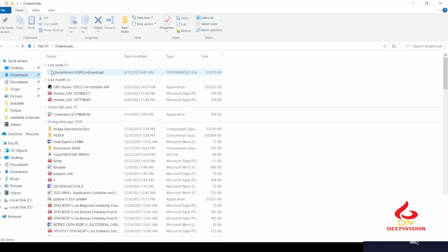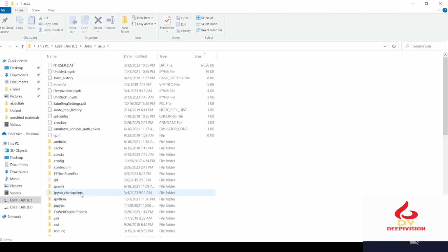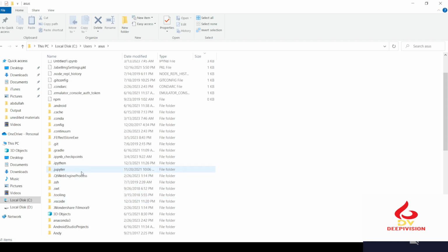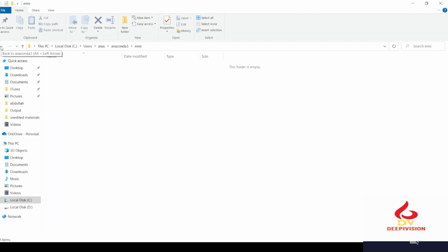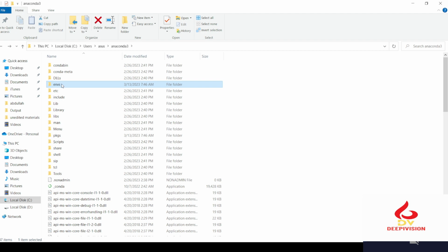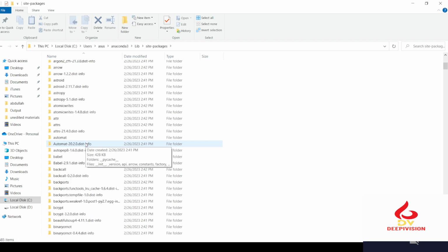Here I have already downloaded it, and I put this in the C drive. Okay, you also need to download here and just cut from here and paste in the C drive, Users here, and then Anaconda3. Go to Anaconda3. If you have an environment, then go to environment. In my case, it's in the base. There is no environment. Okay, so if you create a virtual environment, then you need to go to environment and then lib. In my case, there is no environment, so this is base, and here is lib and site-packages. Here is openslide.